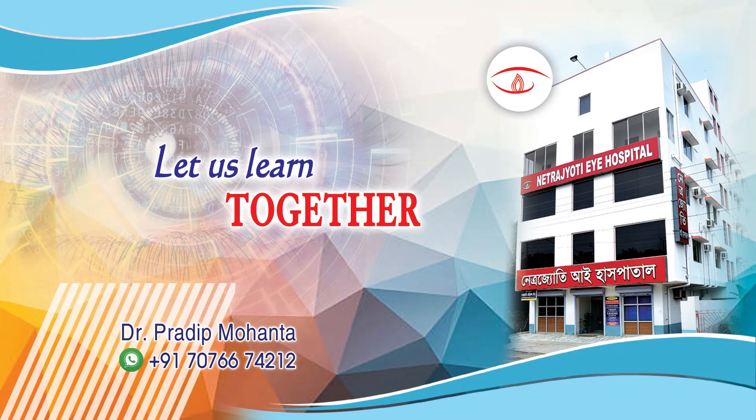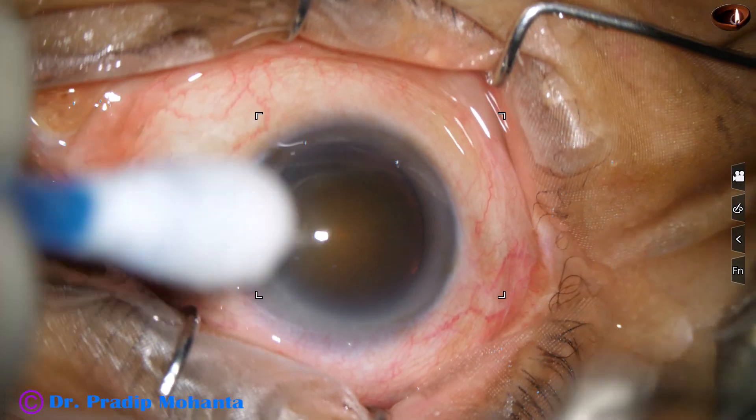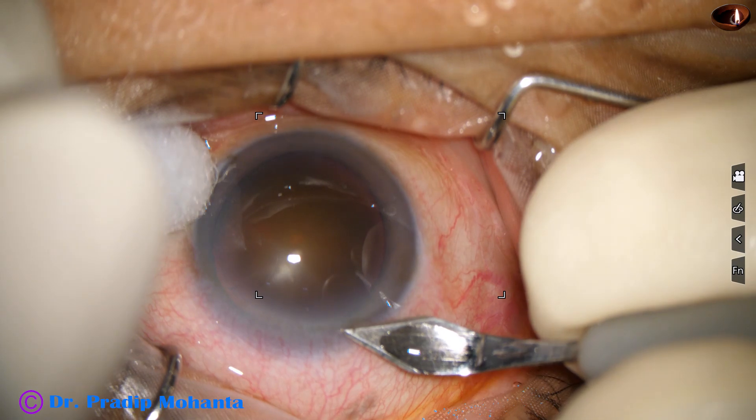Friends, welcome to my workplace at Ranagahar, West Bengal, India. This is a totally un-edited recording of phacoemulsification of this hard cataract.